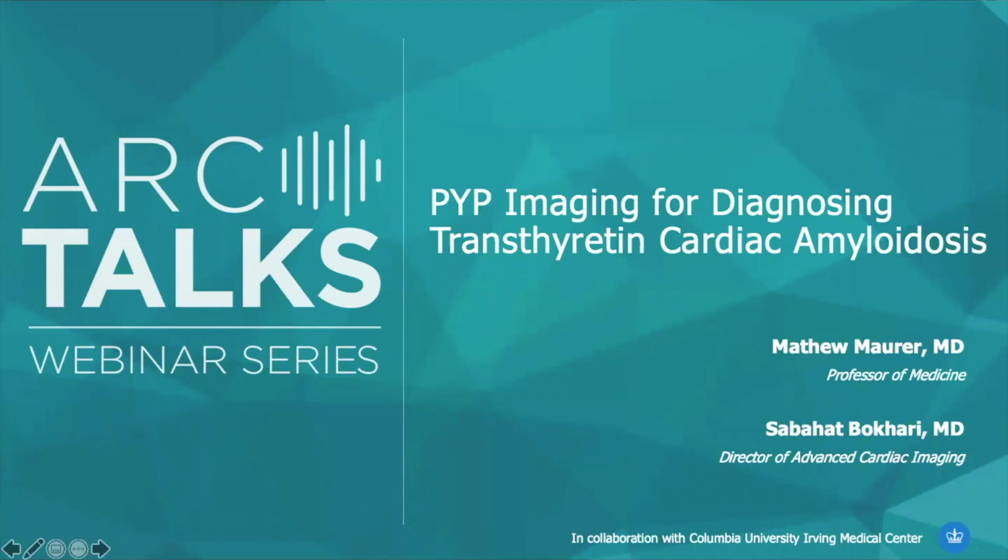Welcome to ARC Talks. The ARC's webinar series is focused on improving diagnosis and care of amyloidosis patients. With the approval of the first treatments for ATTR amyloidosis, it has never been more important to quickly and accurately diagnose and treat patients with these progressive diseases. To address this, today's webinar is about PYP imaging for diagnosing transthyretin cardiac amyloidosis. The use of PYP has revolutionized non-invasive diagnosis of ATTR amyloidosis, but it's critical to understand the proper use and limitations of this tool to improve diagnosis.